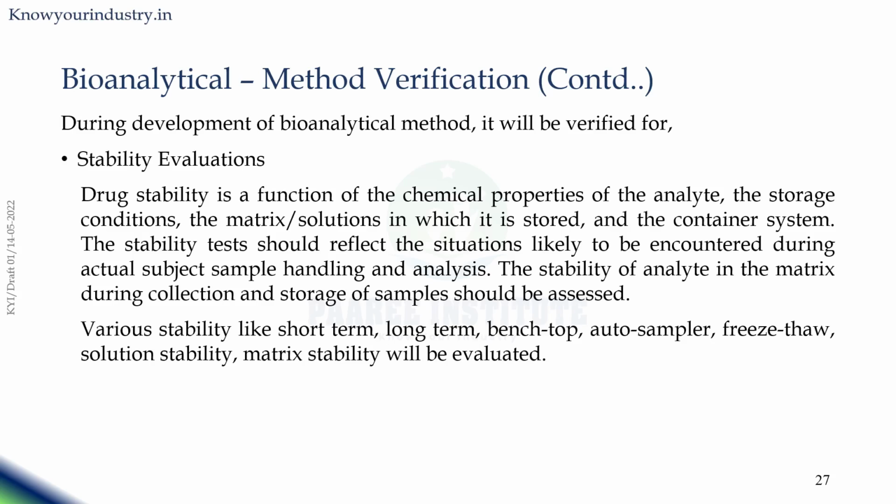The stability tests should reflect the situations likely to be encountered during actual subject sample handling and analysis. The stability of the analyte in the matrix during the collection and storage of the sample should be assessed. Various stabilities like short term, long term, bench top. Bench top means whatever sample you prepare and keep on the particular day. Then the autosampler, freeze-thaw, meaning how many times you take the blood samples, return them to the freezer and take them again, then the solution stability and matrix stability will be evaluated.